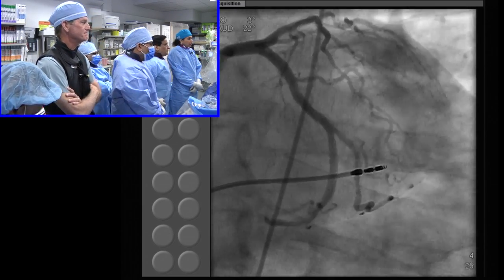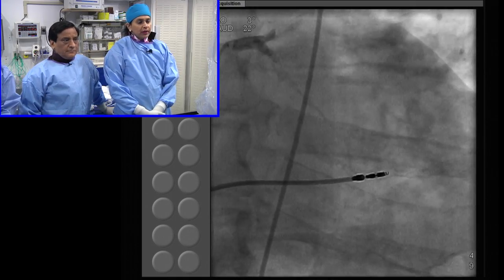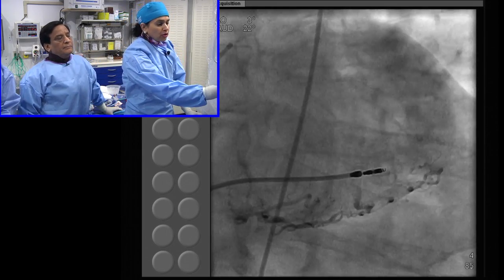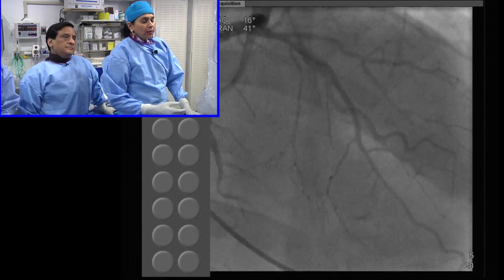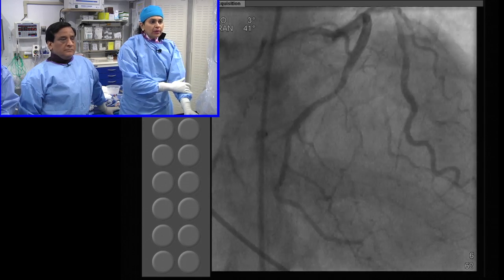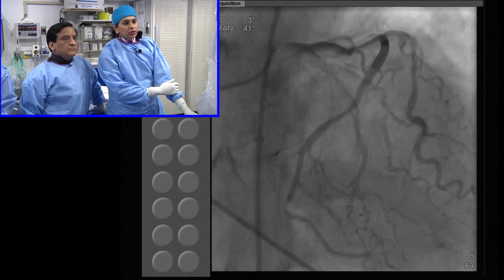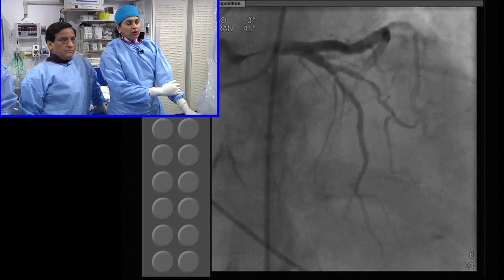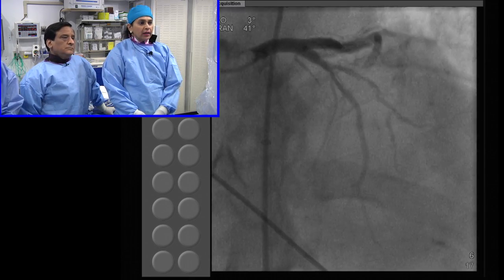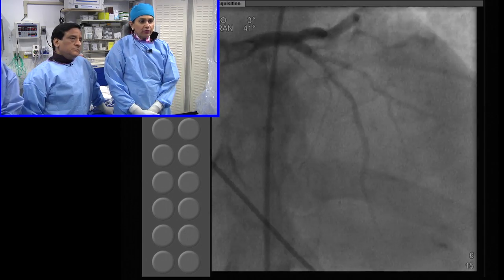Thanks for that. So OM is a small size vessel. Most of the disease is in OM2. That's where the FFR was positive. Again, it's a branching vessel. There is an ostially significant branch of that OM, and this is where the LAD, if I can show you a better picture, prox LAD just at the level of the septal, probably the calcific significant disease. Just like Chuck mentioned, looks like eccentric, most of the calcium probably only one wall rather than you see tram track calcium, and the diagonal ostium is spared, but further down you have significant disease in a branching vessel.